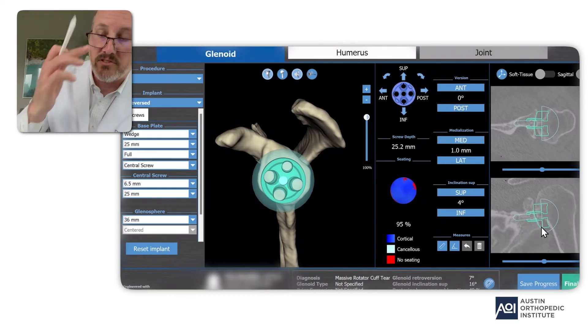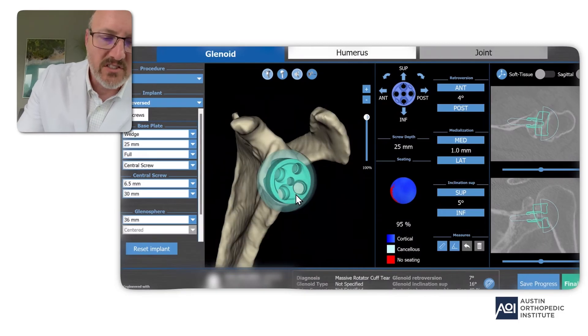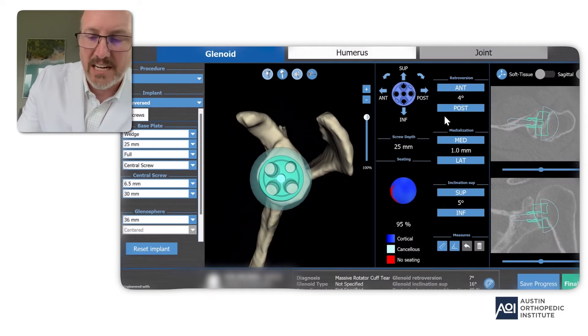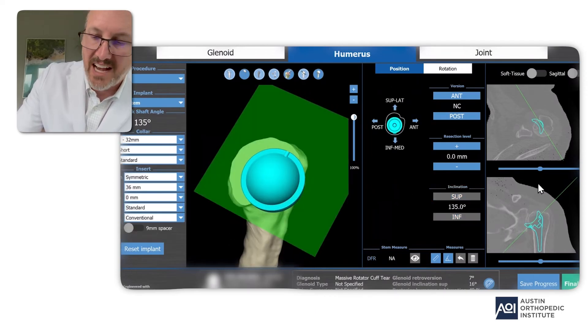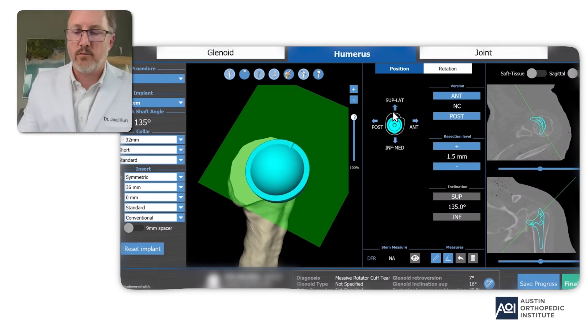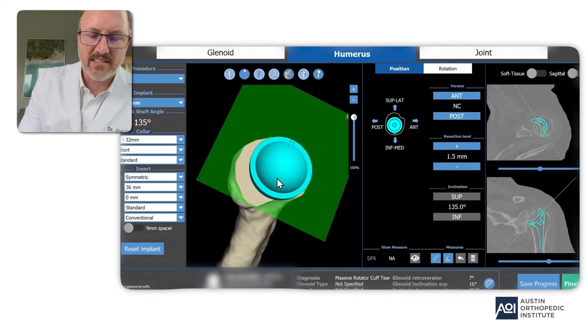I'm moving it down and seating it a little bit better, making a couple more adjustments, trying to perfect the implant position. I still need to get the screw down the center, so I'm going to rotate a little bit — now you can see that screw is getting into better bone. I'm changing the length until I get fixation with the threads all the way out; I don't mind if it's a little prominent but not too prominent. Now here's the humeral side — this is not as critical because I'll perfect it at the time of surgery. I can get an idea of initial size here, though the exact position and even size will depend on what we find in surgery.